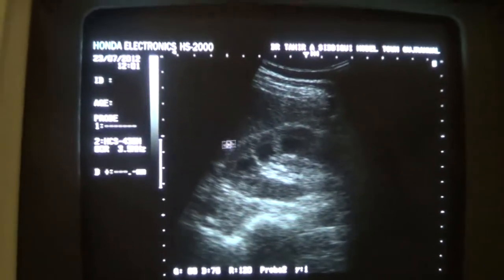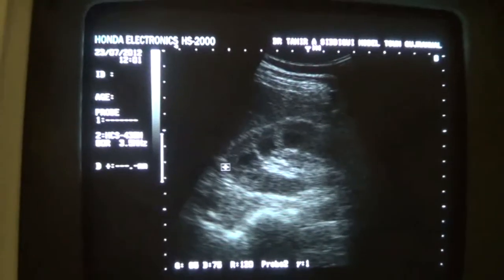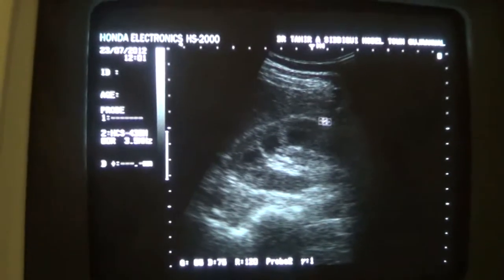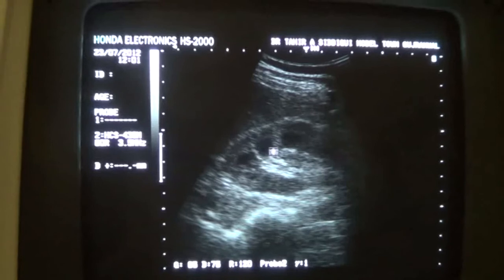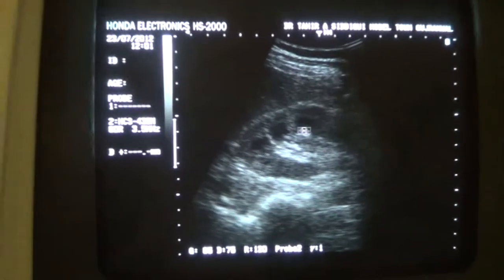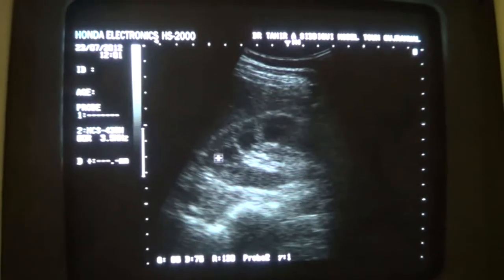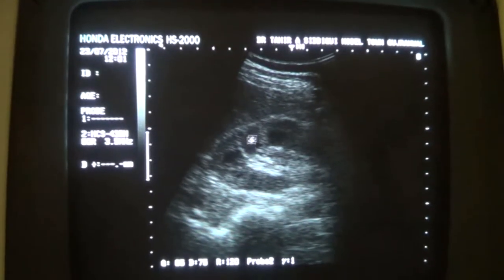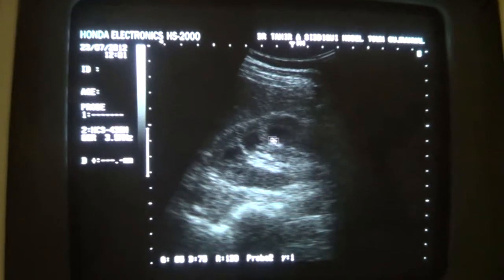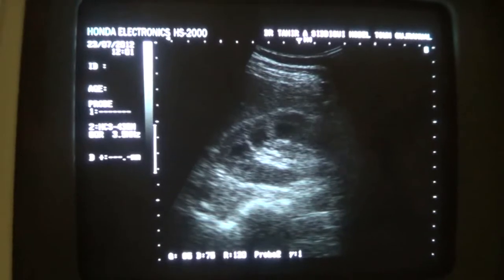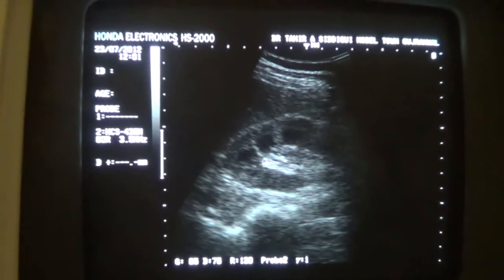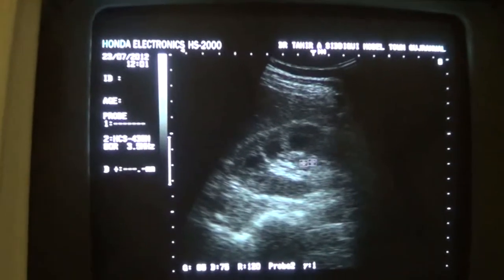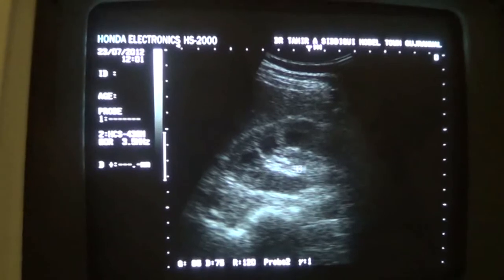This is the right kidney. This is the capsule, this is the cortex, and now these tiny cystic areas that you are seeing in the medulla are the pyramids. The pyramids stand out very prominent compared to routine normal. The patient has severe pyuria, and this is the central sinus echogenic area — central sinus fat collecting system.